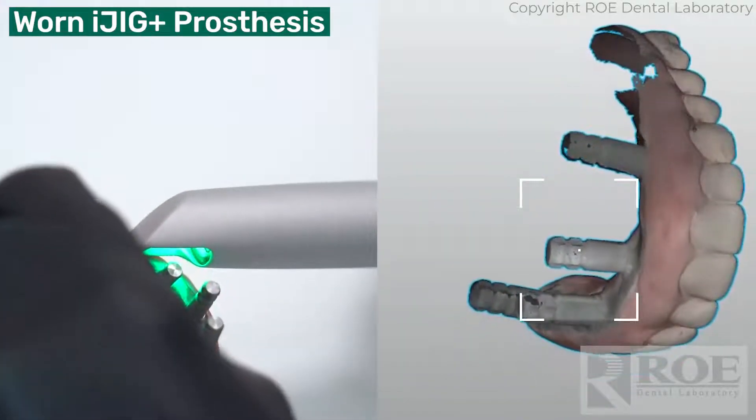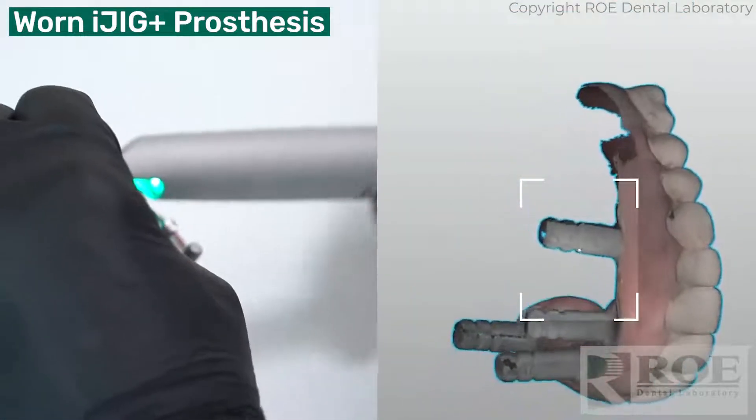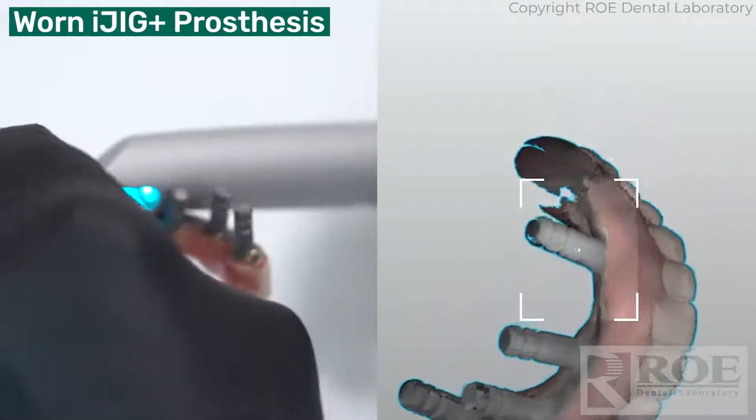Try to get these scan body analogs as good as you can, because we use software that recognizes them and then registers them.